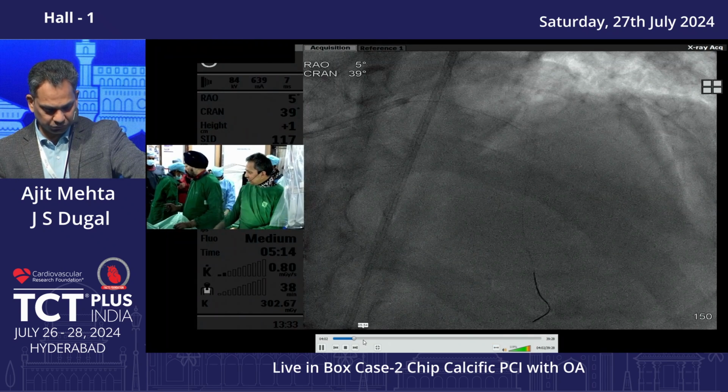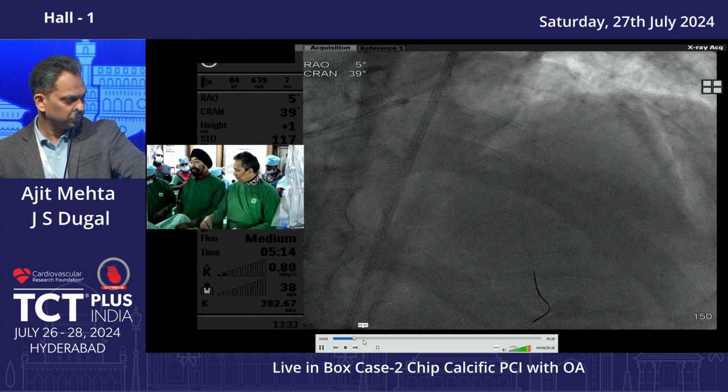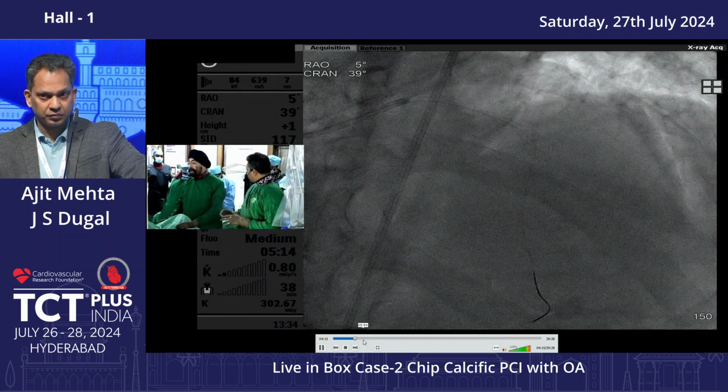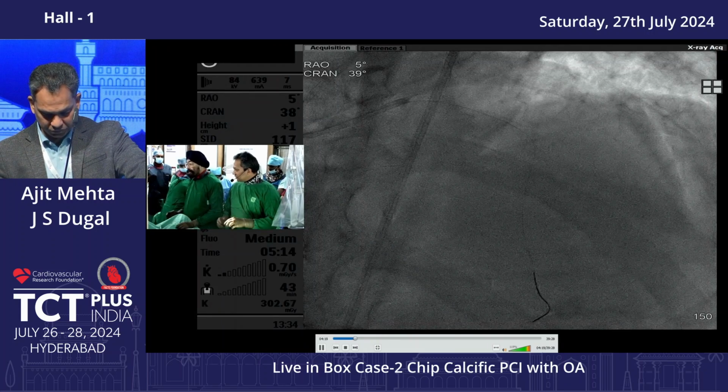If you are doing atherectomy in left main to LAD, do you intend to go beyond the diagonal, or keep it before the diagonal? Before the diagonal. Here the vessel suddenly becomes very tapered, and there is an angulated portion, and there is not much calcium there. There is a size discrepancy, and the calcium is located more in the proximal area.